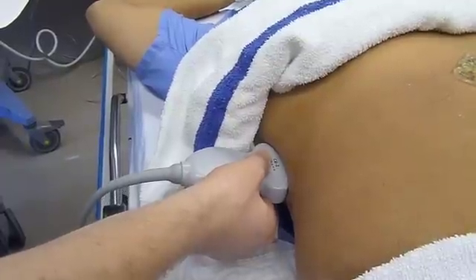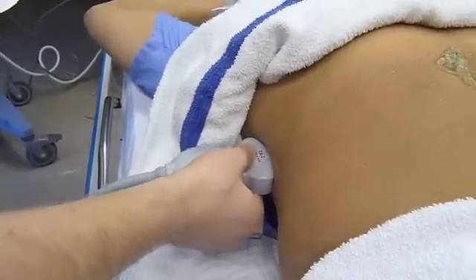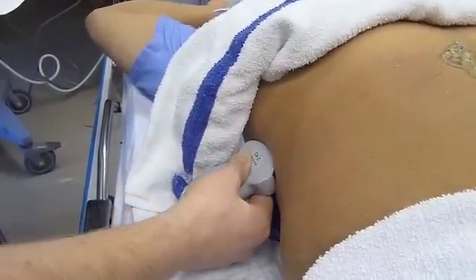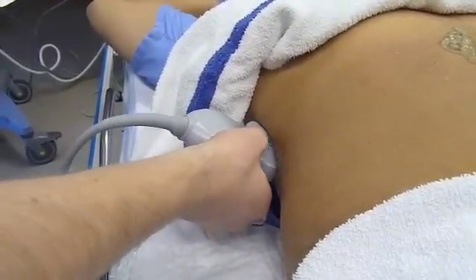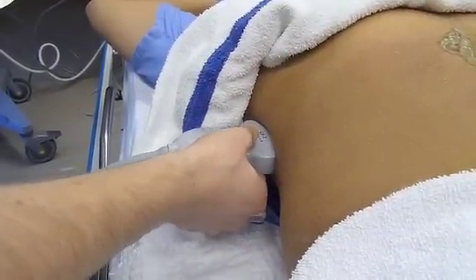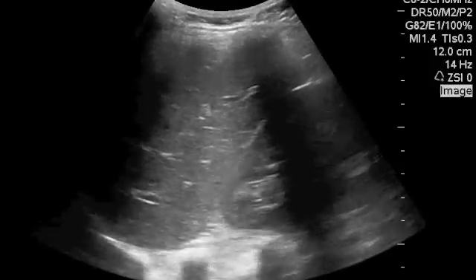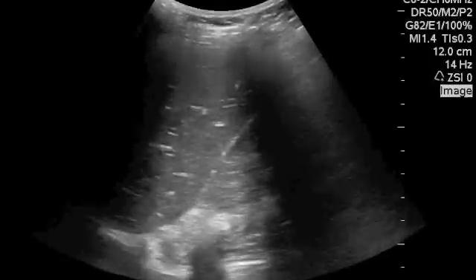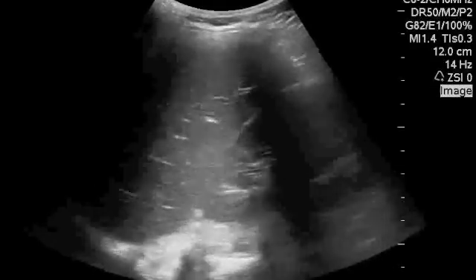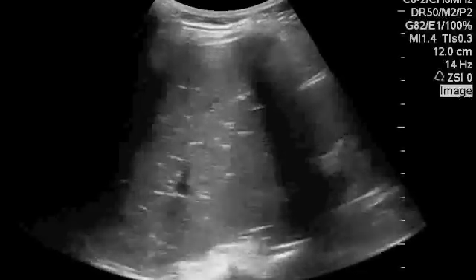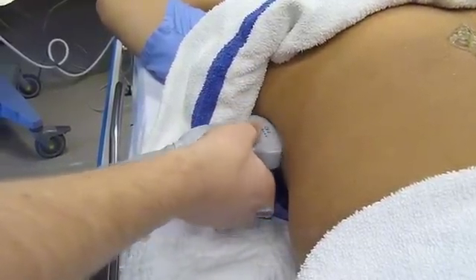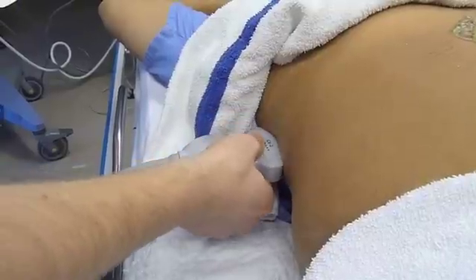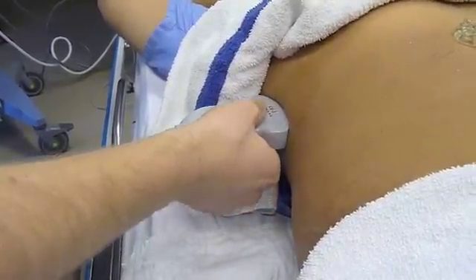Now that I've found my interface, I need to sweep. Here's what a sweep looks like — I keep my contact point constant and I tilt the probe in each direction, anteriorly and posteriorly. Before I sweep, I optimize my depth. You need to see the kidney disappear in both directions. Don't sweep like this — here I'm not keeping my contact point constant. I call this 'painting' because it looks like I'm painting a fence with the probe.